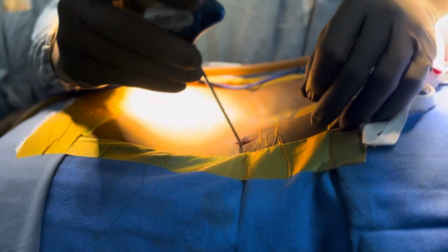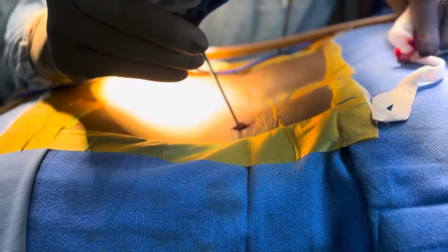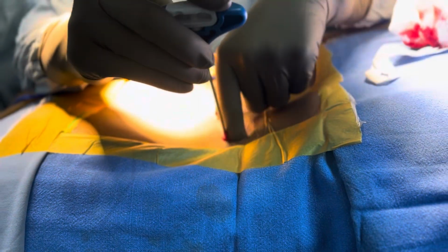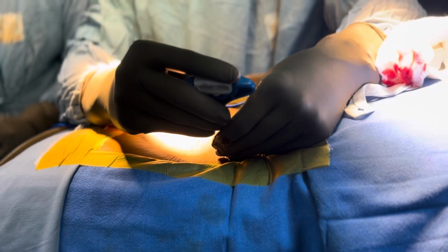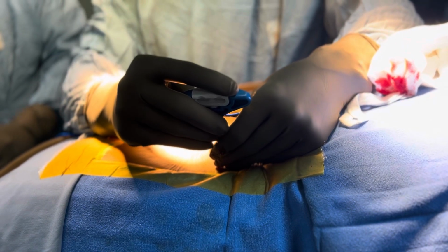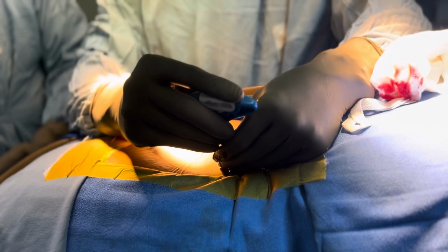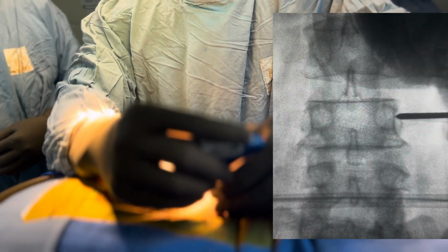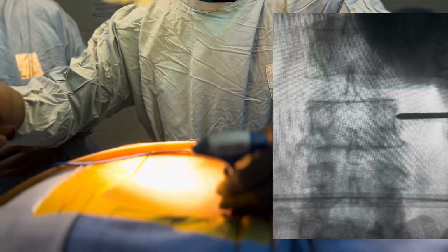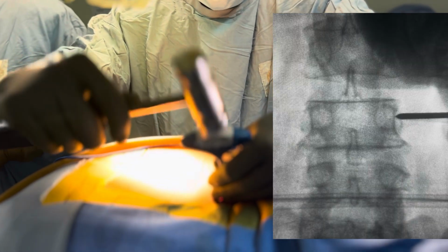This is a cannulated needle from which the guide wire can go once it is in the pedicle. So I am on the lateral border of the pedicle at the center on the C-arm. So I am going to tap it with a hammer.